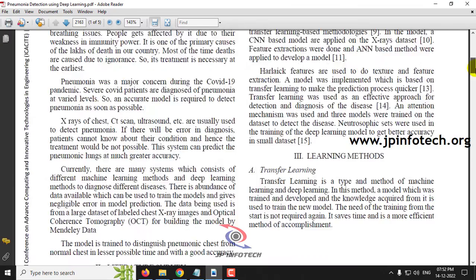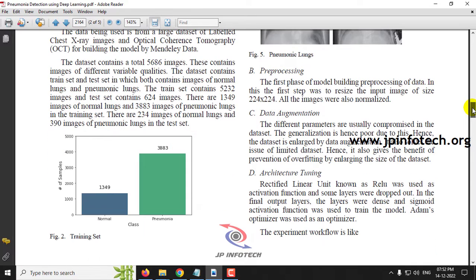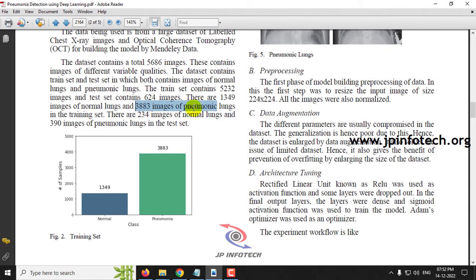Coming to the dataset — it consists of around 5,686 images, with both a test set and a train set. The train set consists of 5,232 images: 1,349 normal lung images and 3,883 pneumonia lung images. The test set consists of 624 images total, where 234 images are for normal lungs and 390 images are for pneumonia lungs.